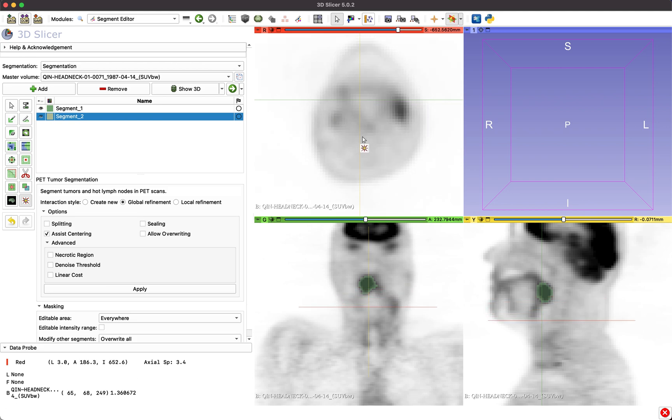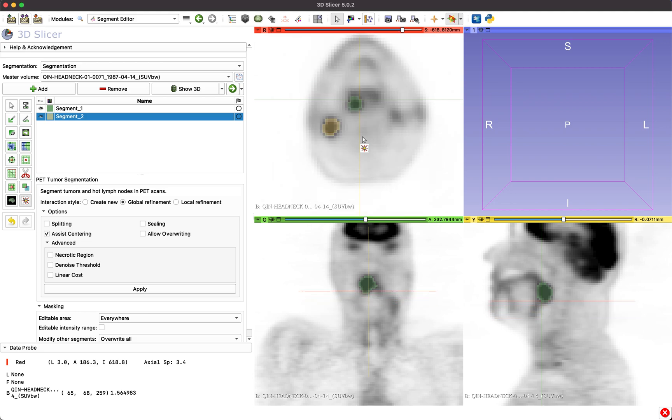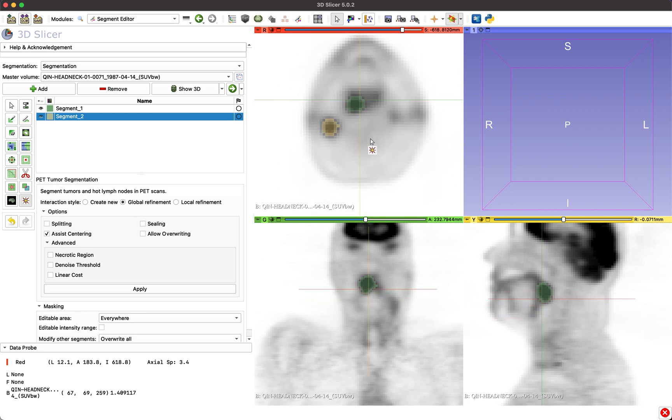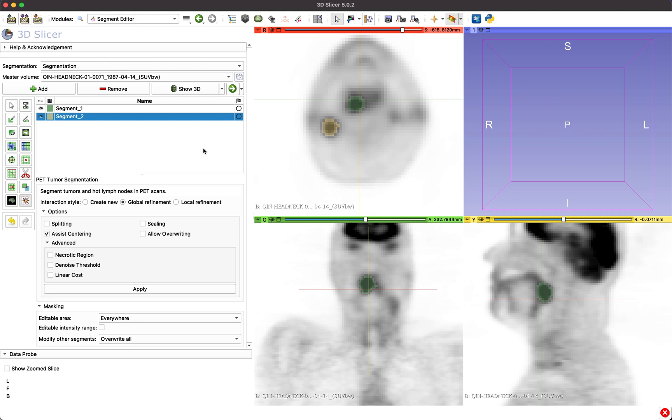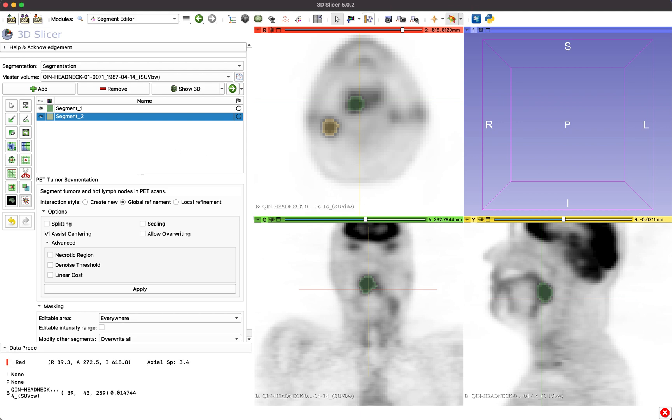However, in some situations, more user interaction may be required. In these cases, the tool offers different interaction styles and options to provide additional guidance to the algorithm.